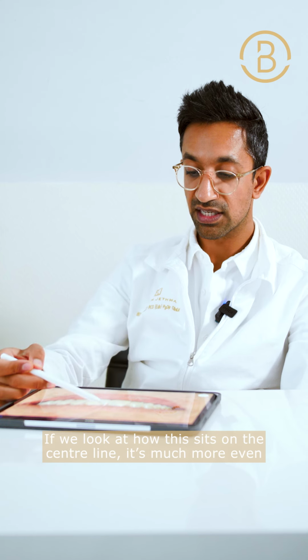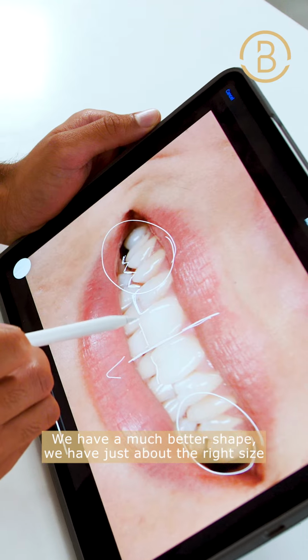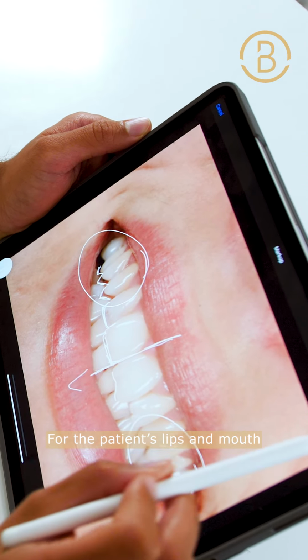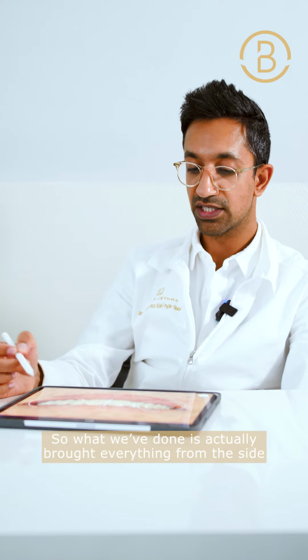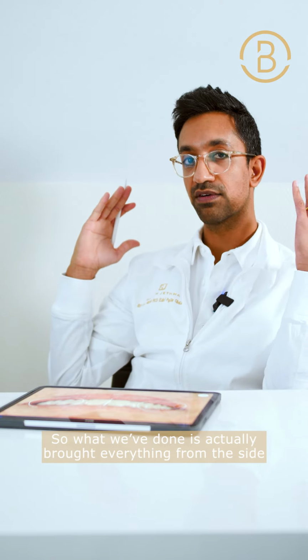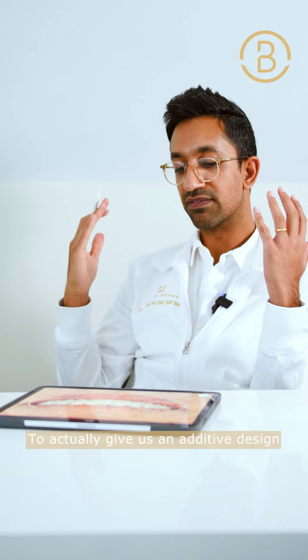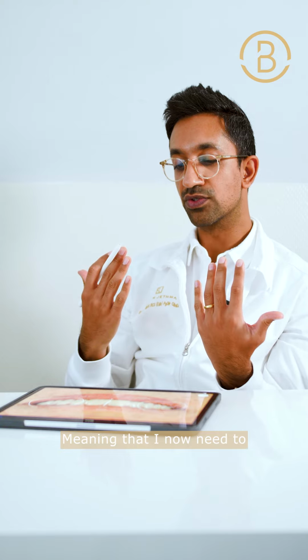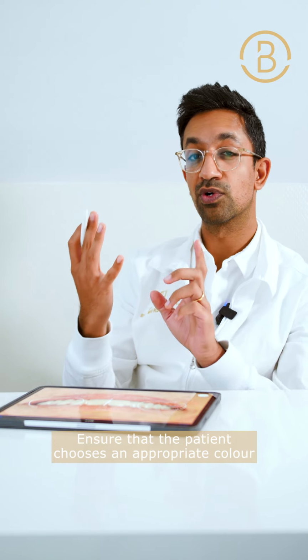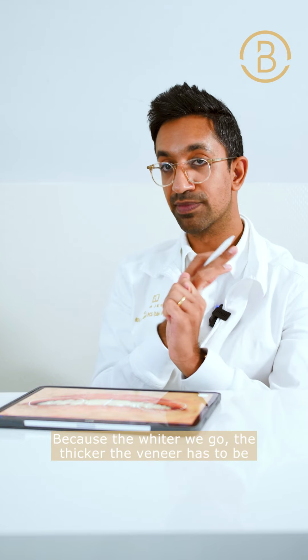And we did. If we look at how this sits in the center line, it's much more even. We have a much better shape. We have just about the right size for the patient's lips and mouth, and we're filling out the volume at the side. So what we've done is actually brought everything from the side a little bit more voluminous to give us an additive design, meaning that I now need to ensure that the patient chooses an appropriate color, because the whiter we go, the thicker the veneer has to be.